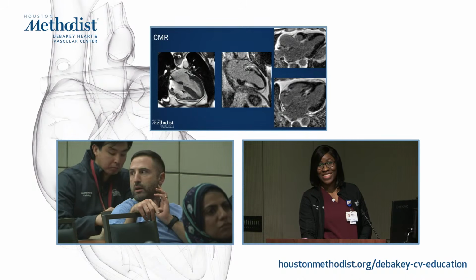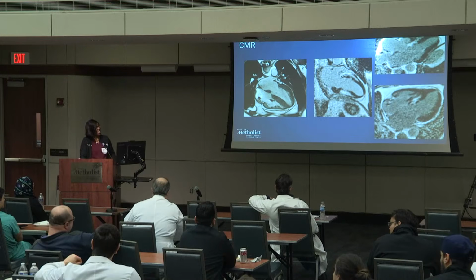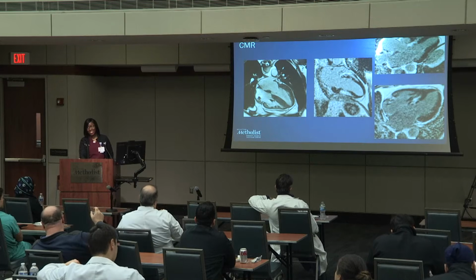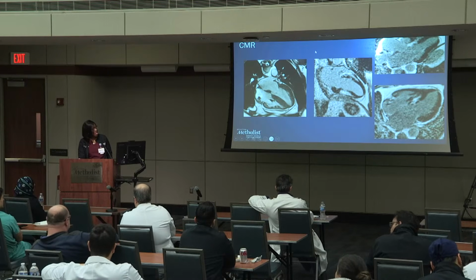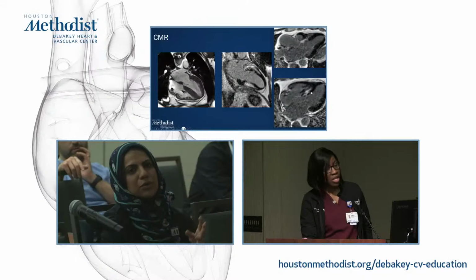That's way out of range for what you see with ablation. You hope that they don't burn the ventricle. That's way out of range. You could see it, but it would be very focused. Small, like basal septum. This is an acute therapy, and the ablation was focused on the septum. It was a basal septum. But then also the septum was just transmural.